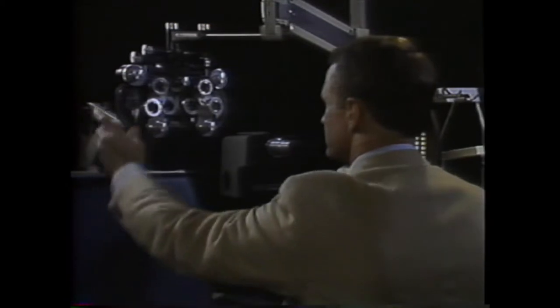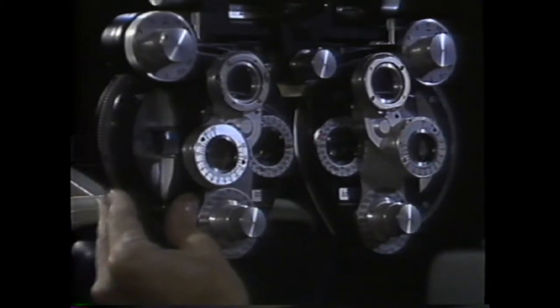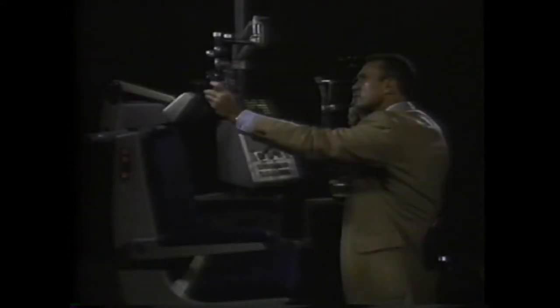Remember, with movement tells you to change sphere in the plus direction, to dial down on the phoropter. Against movement tells you to change sphere in the minus direction, to dial up on the phoropter. It's really very straightforward.